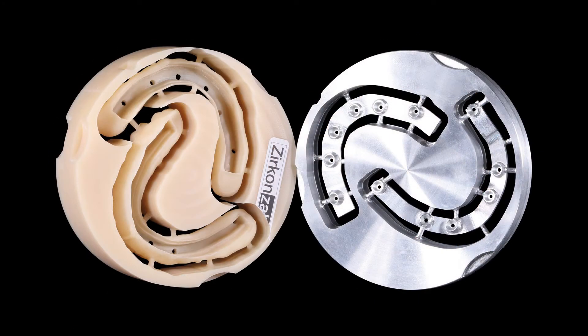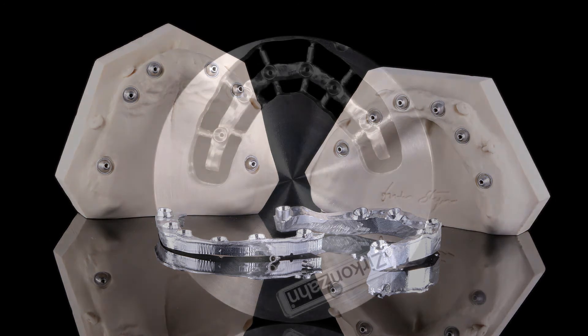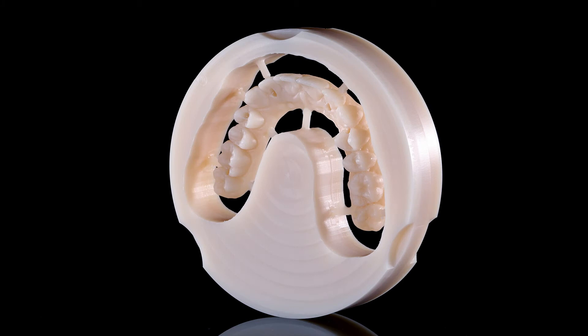After the healing phase, the patient situation was digitized again with the intraoral scanner. The aluminum bars as well as the verification prototypes were milled. After a positive try-in, the titanium bar for the lower jaw was fabricated.